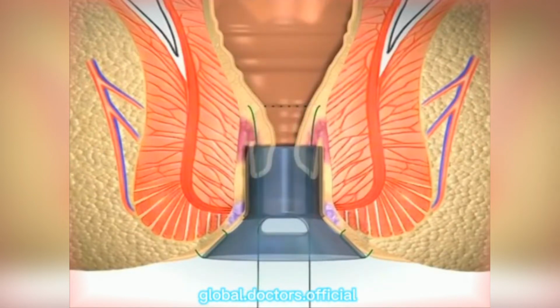The purse string sutures are placed close together, 6 to 12 small bites, to allow better traction of the mucosal prolapse. Each insertion of the needle is near the exit point of the last insertion. The purse string should be at the same level circumferentially.